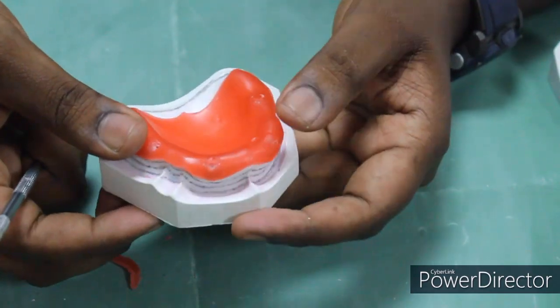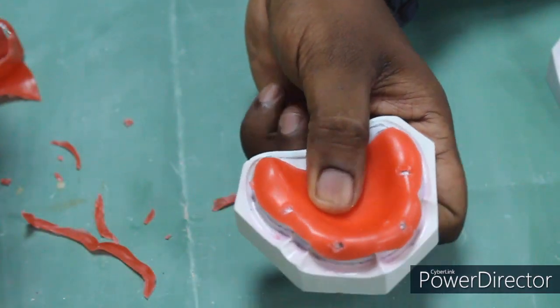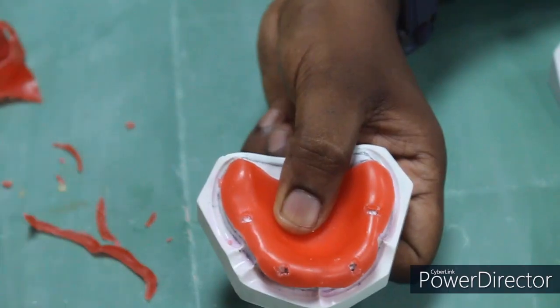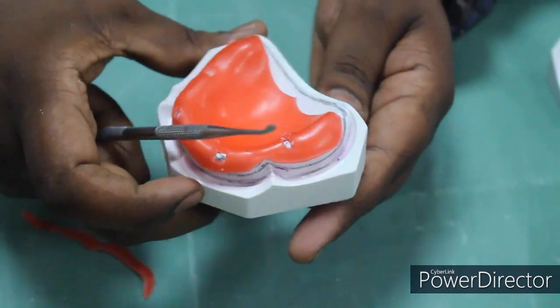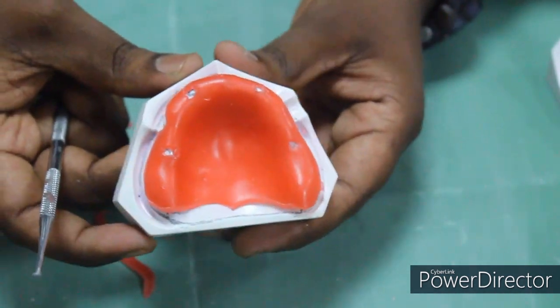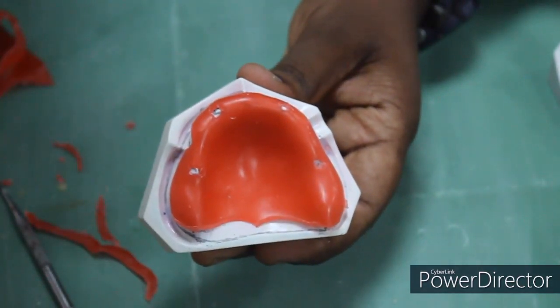So 4 stoppers is the final count after adapting the base plate wax. Similarly, you have to do it for the mandibular arch.